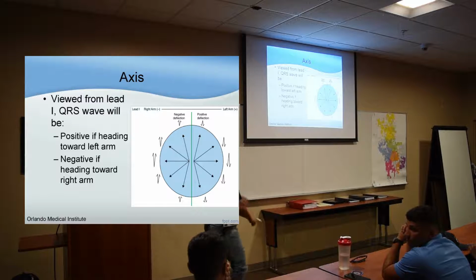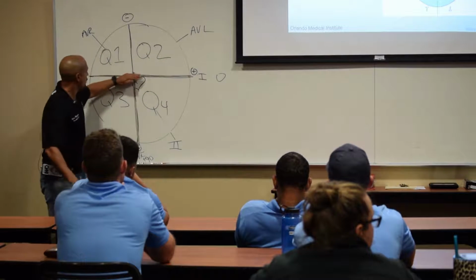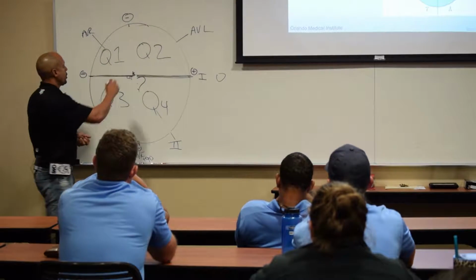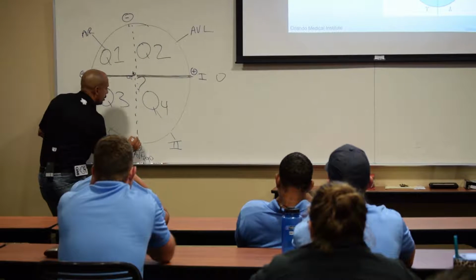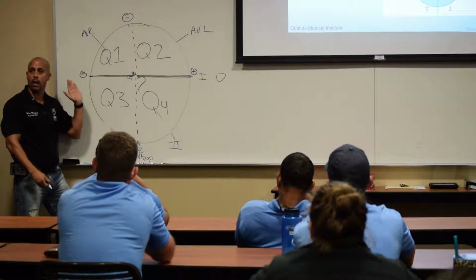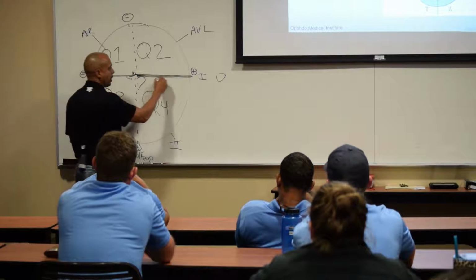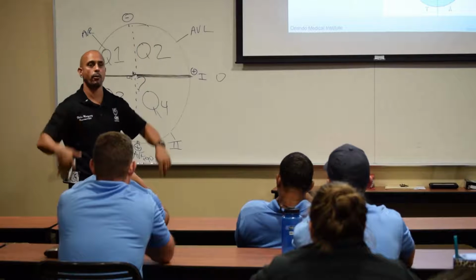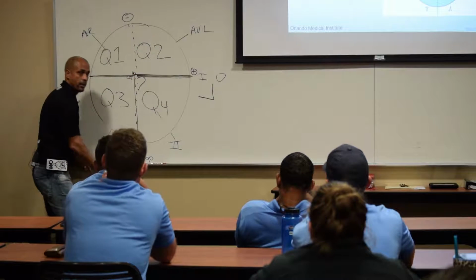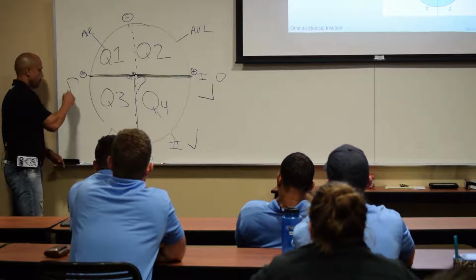All right. So if I used just this one, this is lead 1, right? Lead 1. This lead right here, I take this away. Lead 1, I separate top to bottom. Everybody with me? So this is an imaginary line. Why do I need an imaginary line? Because everything on this side of the line is going to be what? Everything on this side of the line is going to be what? Negative, right? So if I'm moving directly to lead 1, my deflection should be upwards or downwards? Upwards, because I'm moving towards the what? Very good. How about here? I'm still on the positive side, so my deflection would still be what? Upward. How about if I was going this way? Downwards. All right.